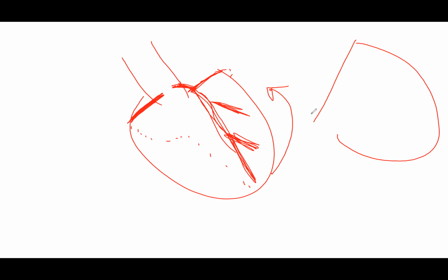They're just looking, imagine you're looking through the sternum, okay? And then circ goes like this, so it's circumflex, right? And then LAD is coming right in the front, like this. So when they first saw the diags, they were going like this. So they were diagonal arteries. When they lifted this heart up, you can see the base now. Base is like this, okay?